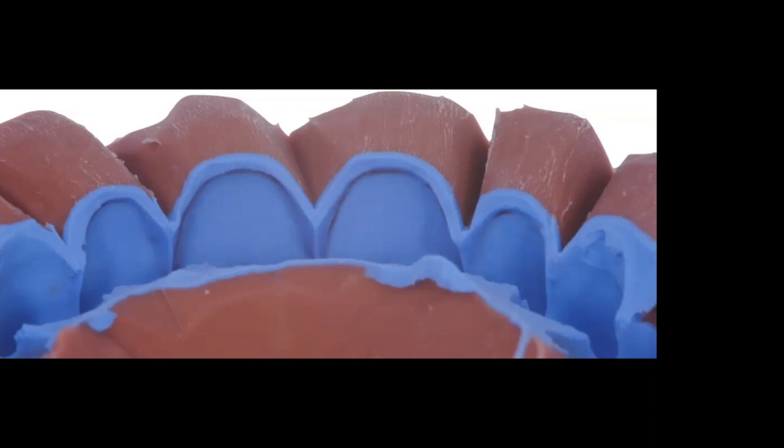You don't want to damage your wax-up because you'll need to make a second impression of it using light-body material — injecting it within the putty matrix and over the wax-up, then seating them together to copy all the details. Once set, remove it, and using a #25 Parker blade, cut notches right at the embrasure locations. This creates vents — when the matrix is seated in the patient's mouth, excess bisacryl flows through those vents, leaving very little trimming.